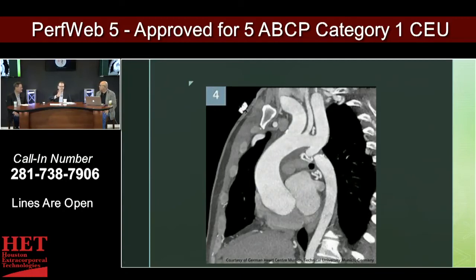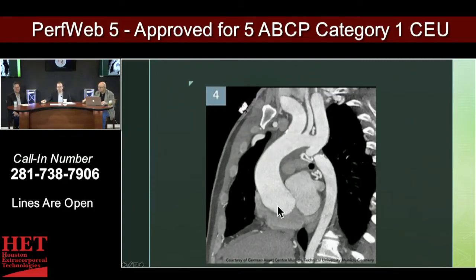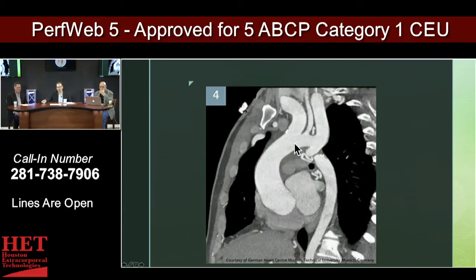This is the sagittal view — moving left to right in the patient. The anterior mediastinum is up here, the sternum coming down, the space where the thymic gland remnant is. This is the root of the aorta. What tells me this is long-standing is how big and huge the innominate and left subclavian are — indicative of hypertension in this region, meaning those vessels have dilated over time. If you scroll back and forth you'll see all the collaterals connecting to the descending thoracic aorta.